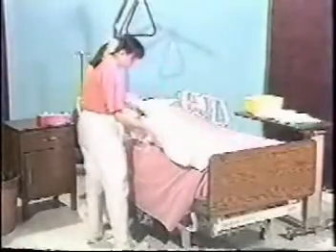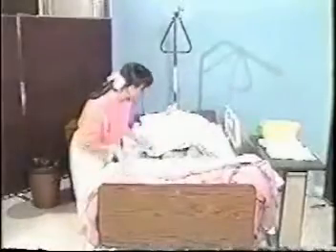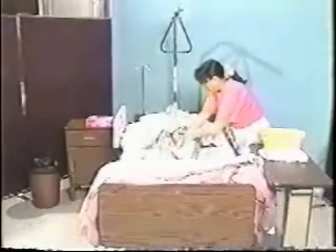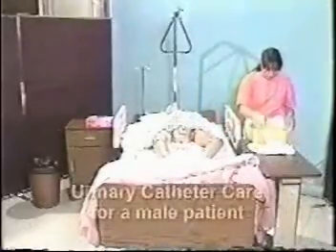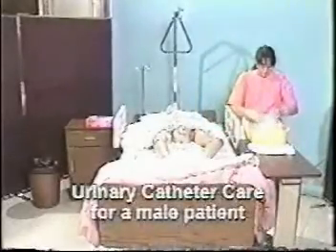Cover the patient with a bath blanket while fan folding the top linens to the foot of the bed. Place the towel or bed protector under the buttocks. Position the patient on the back with legs separated and knees flexed. For the male patient, place soap and water on the washcloth.